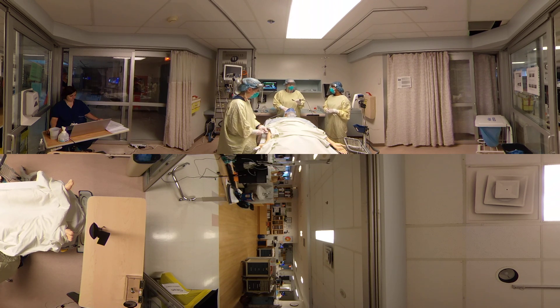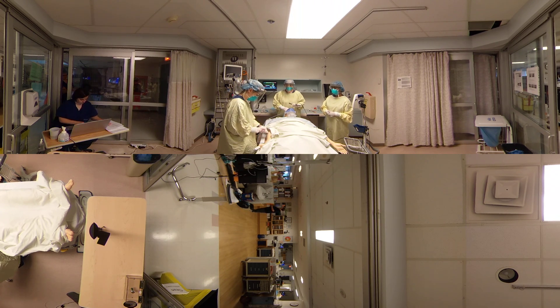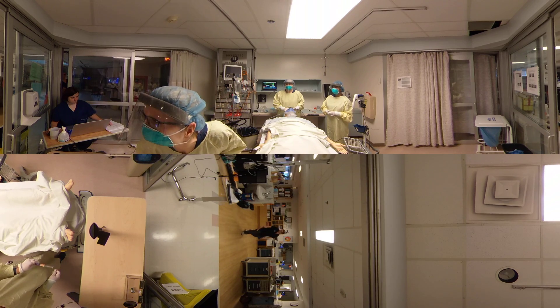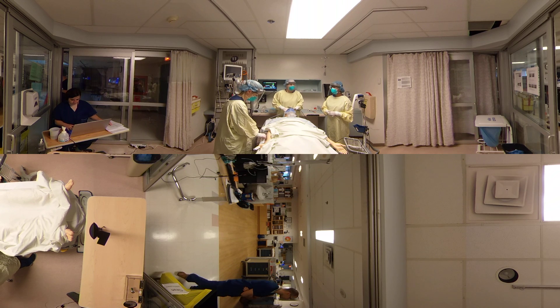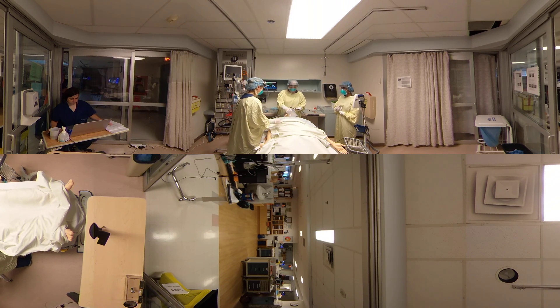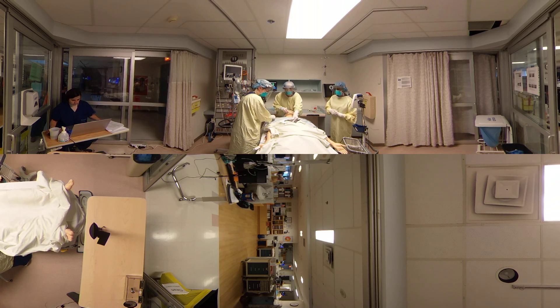Blood pressure is 67 on 47. Let's follow that with the ephedrine, please. Prahima, can you count to 30? One, two, three... [counting to 30 seconds for medications to take effect]. Slide it out, please. Let's have the cuff up first. I've visualized — it's in the glottis. Put the bag on, please. Can you bag, Stephanie?